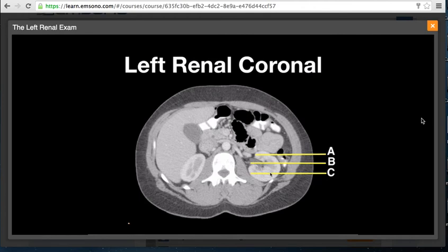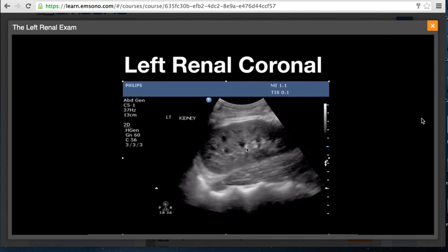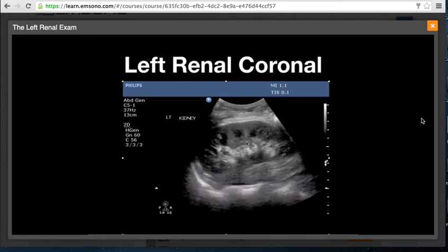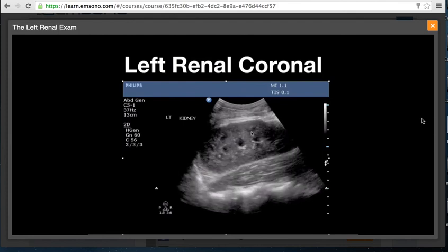If you are in scanning planes A or C, you will get a nice view of the parenchyma but no view of the renal pelvis, and you will miss hydronephrosis. You need to sweep enough to confirm you are visualizing through the renal pelvis. In this coronal sweep of the left kidney, the hypoechoic renal parenchyma, the echogenic renal pelvis, and anechoic medullary pyramids are seen. Note that at times during the sweep the imaging plane is off-axis to the renal pelvis — even though the kidney is still visible, hydronephrosis would be easily missed.